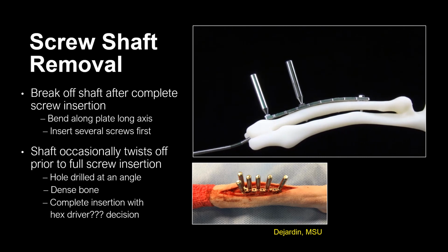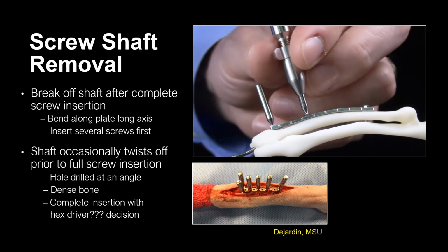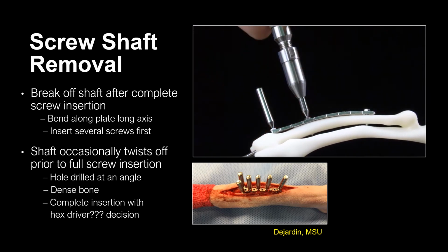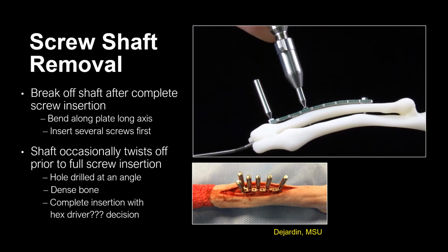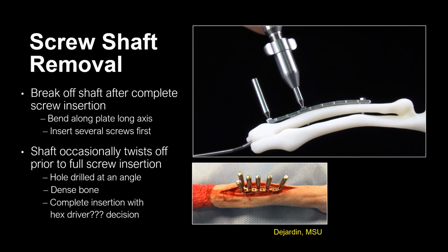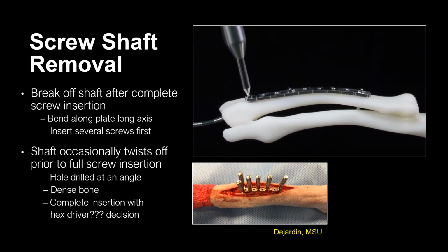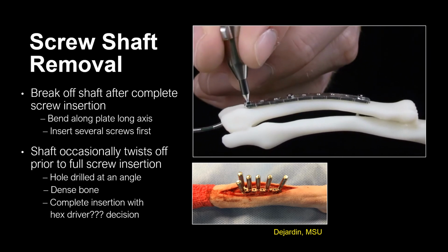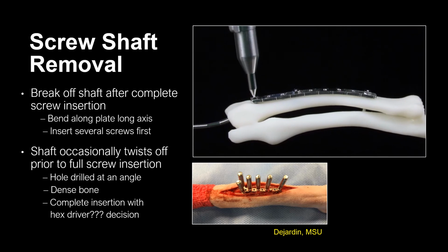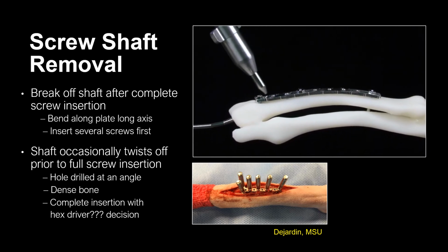Alternatively, with the 1.0 and 1.4 millimeter screws, the screw can continue to be tightened using the finger driver until the shaft twists off of the screw head. A combination of turn and rock is also effective for shaft removal. When using the 1.6 implant set, the rock-off method is the only reliable shaft removal option.